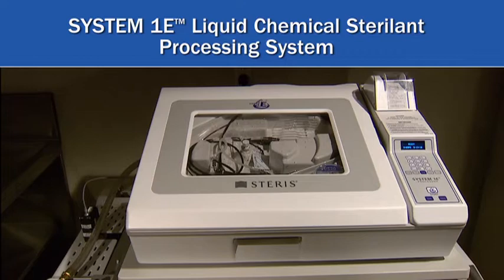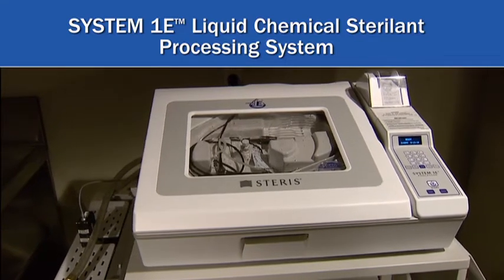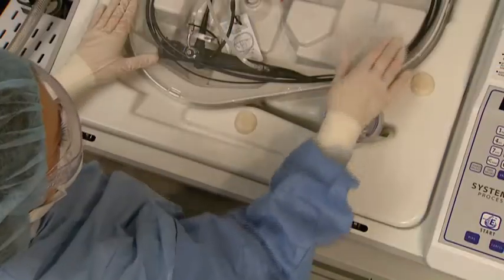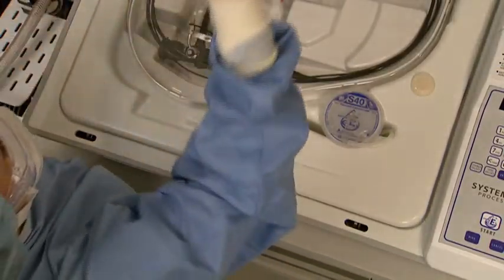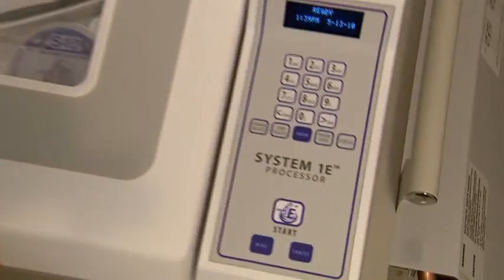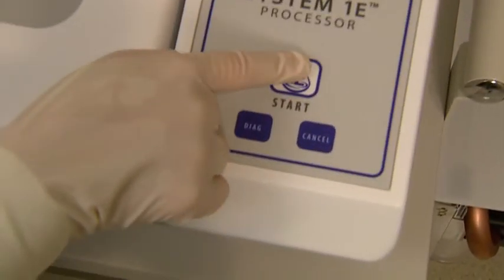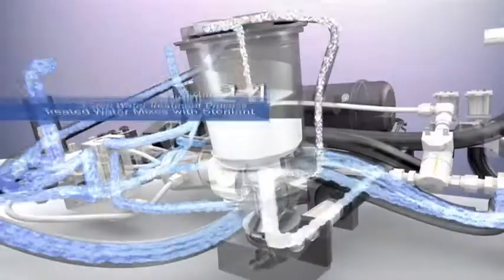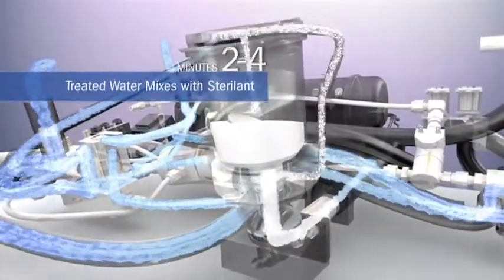Introducing the System 1E Liquid Chemical Sterilant Processing System from Steris. The evolution of the System 1E processor design enhances the science and technology of liquid chemical sterile processing by offering greater productivity and elevating the extensive treatment of potable water to a whole new level.